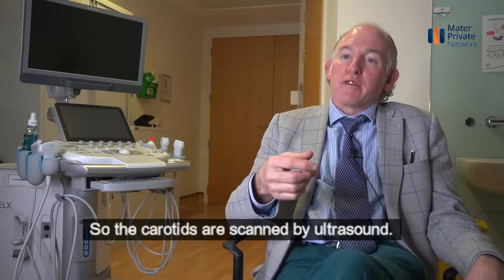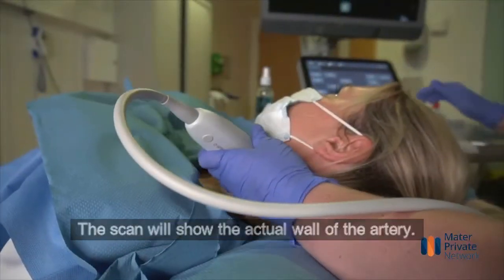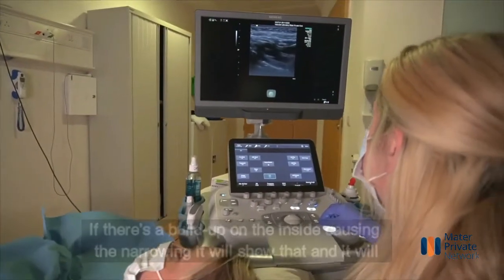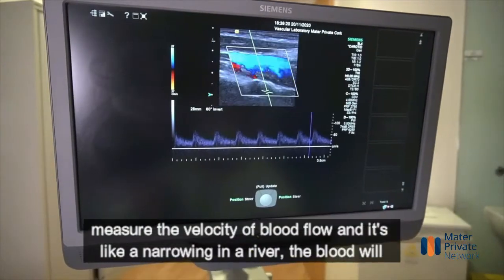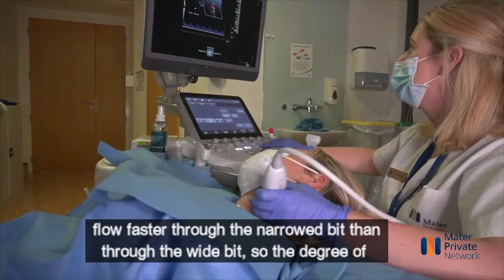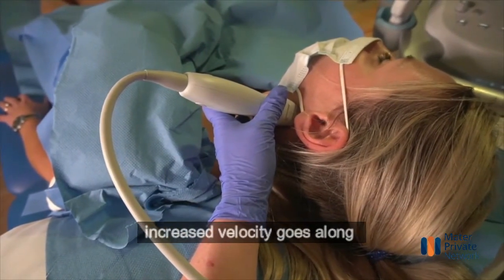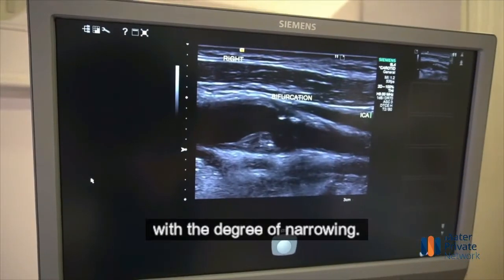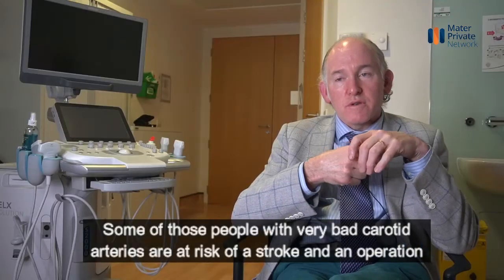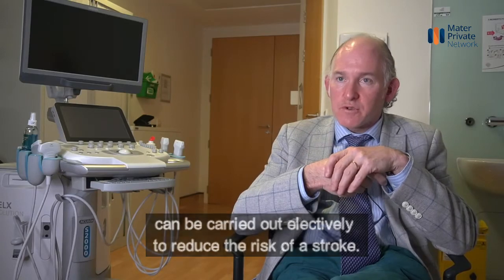So the carotids are scanned by ultrasound. The scan will show the actual wall of the artery. If there's a build-up on the inside causing narrowing, it will show that, and it will measure the velocity of blood flow. And it's like a narrowing in a river. The blood will flow faster through the narrowed bit than through the wide bit. So the degree of increased velocity goes along with the degree of narrowing. And some of those people with very bad carotid arteries are at risk of a stroke, and an operation can be carried out electively to reduce the risk of a stroke.